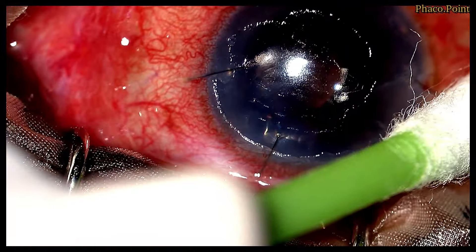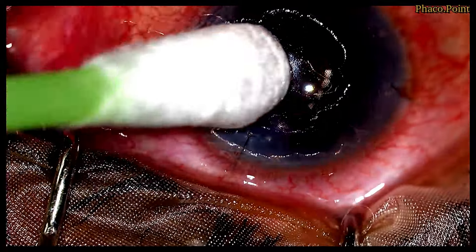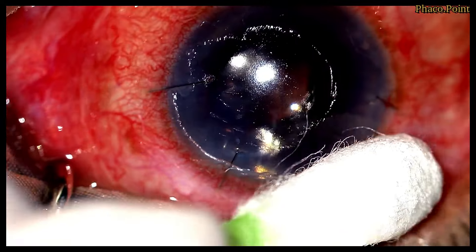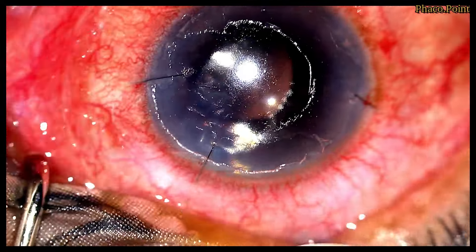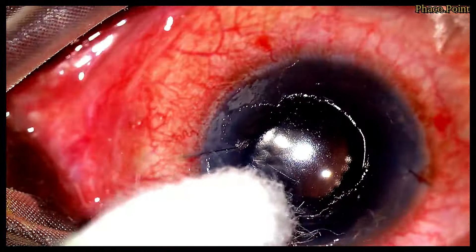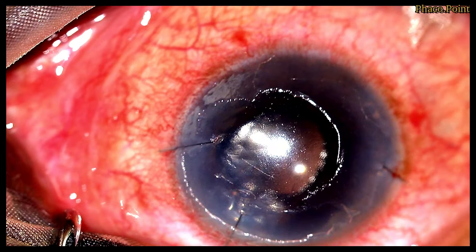I'm taking a little more time to show you that as a few more minutes pass, you will see the cornea clearing further and furthermore. Once I'm happy with the end result, I will leave this full chamber of air in the eye for a couple of hours. In the ward thereafter, the eye will be burped with a 26-gauge needle at a slit lamp under topical anesthetic.